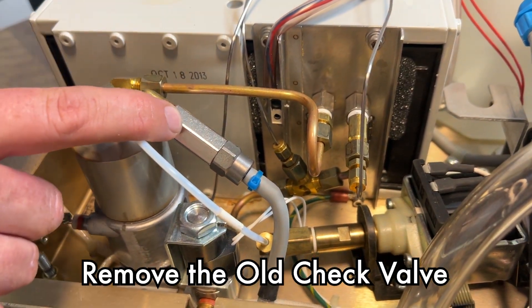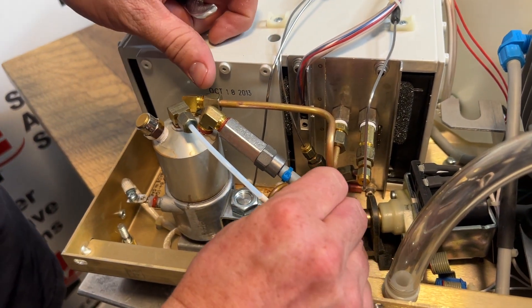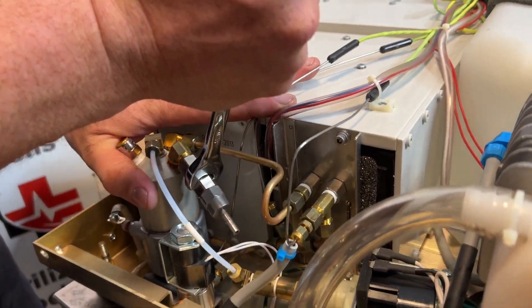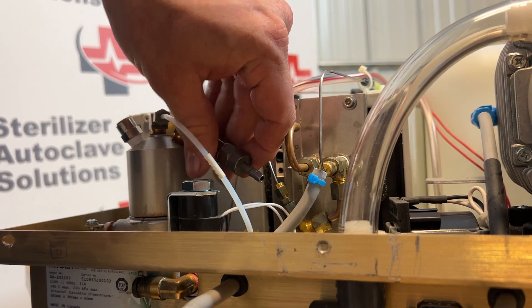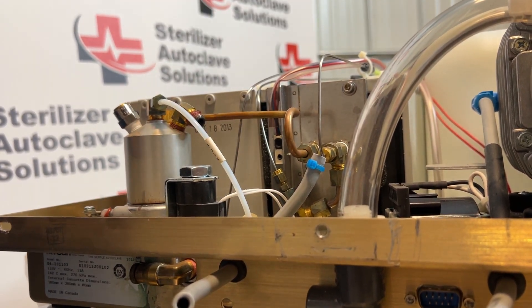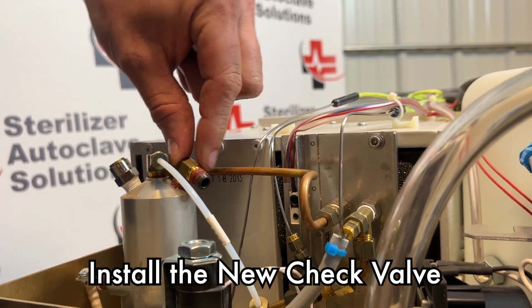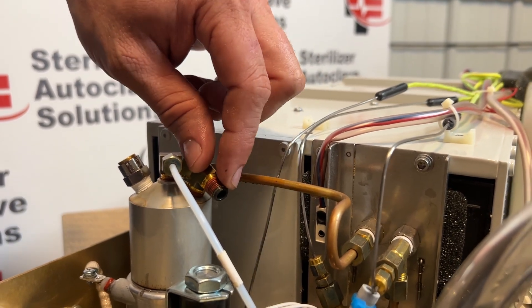If you have an OEM check valve that looks like this, you will need a 9/16ths. This will simply pull off and this will unscrew. You want to make sure that there are no threads — any of this red that's on here — that will not get into that boiler.